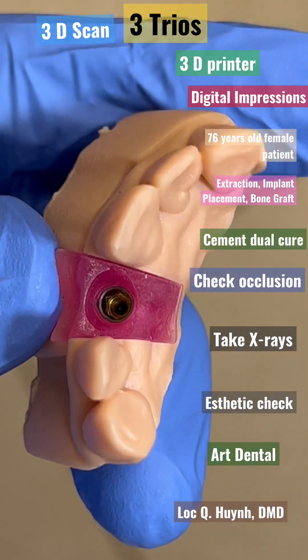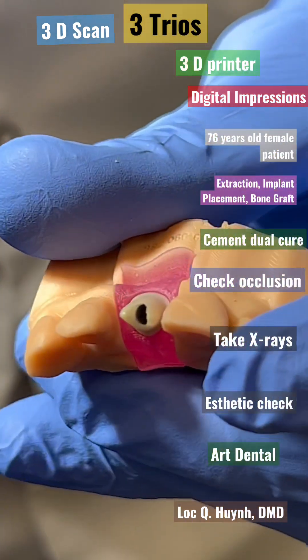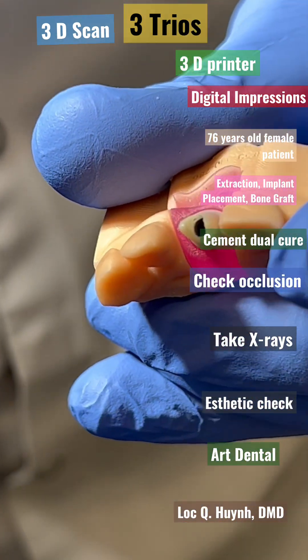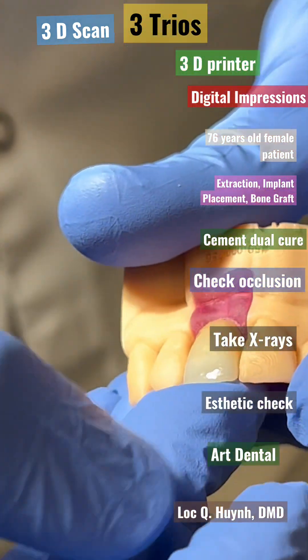Hello everyone. This is a step-by-step how-to restore an implant. The model was printed with the 3D scan and 3D impression, 3D printing.